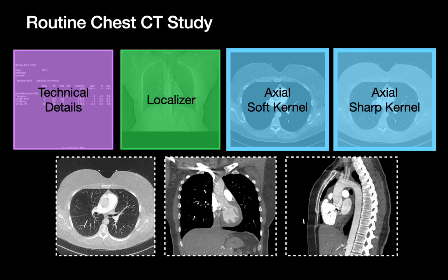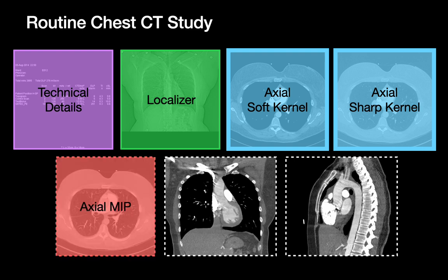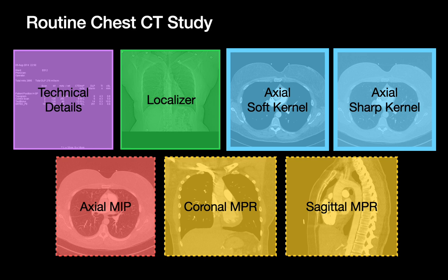Localizer images will usually appear in a different series. These are radiograph-like frontal and often lateral images that the CT technologist used to decide at what table position — down to the millimeter — a CT scan starts and stops. Sometimes you'll also get an axial MIPS series and MPR series that allow you to view the CT volume in the coronal and sagittal planes.